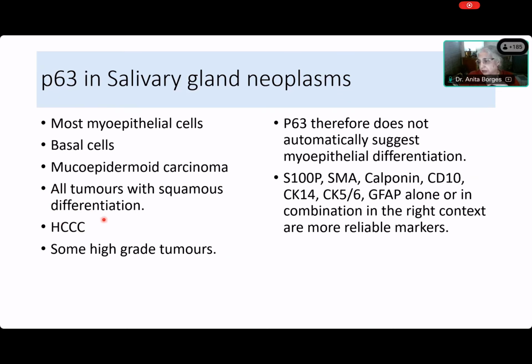The higher the grade, the more often P63 is expressed, because it's just a marker of primitiveness; it's a cell cycle protein. So high-grade tumors will show it. And this just says what I said before, that it does not automatically suggest myoepithelial differentiation. Everybody and his neighbor uses P63 in breast and all sorts of places, and we just assume that this means myoepithelial differentiation if we're not looking for squamous. That's not true, because there are basal cells, and sometimes in very high-grade tumors, you get it. If you want to look for myoepithelial differentiation specifically, then please use a combination of S100 protein, SMA, calponin, and any one of these. So that's what is important about P63.